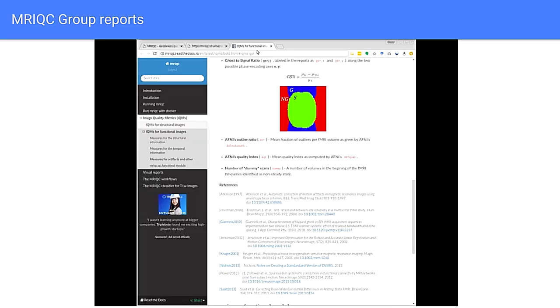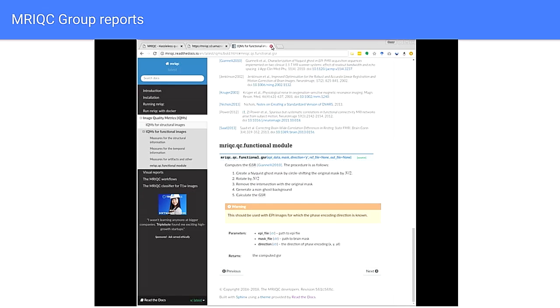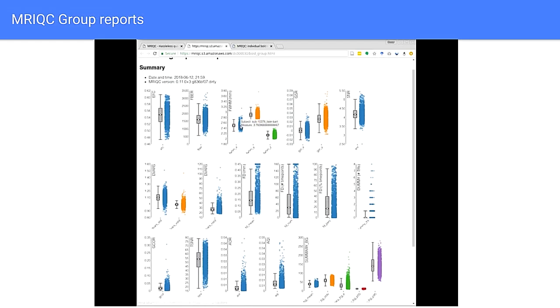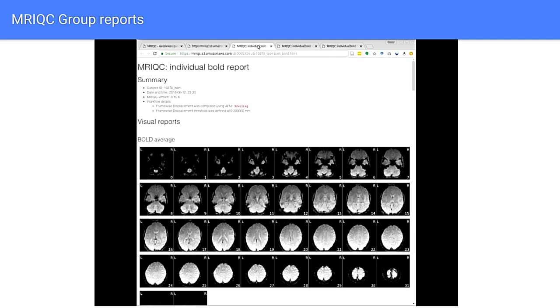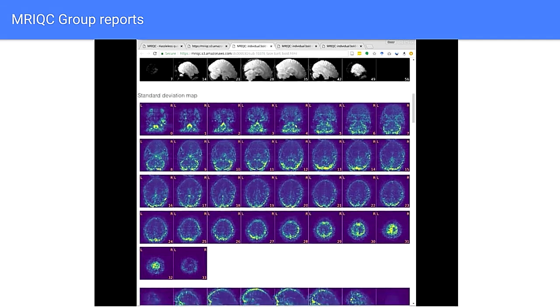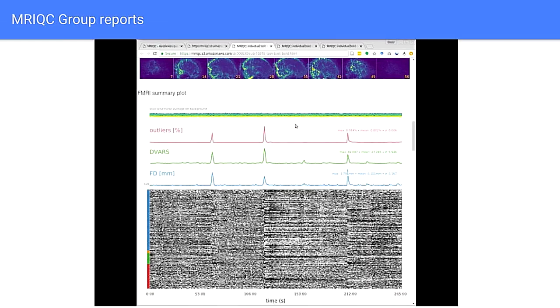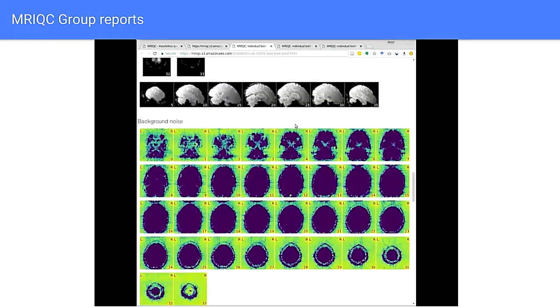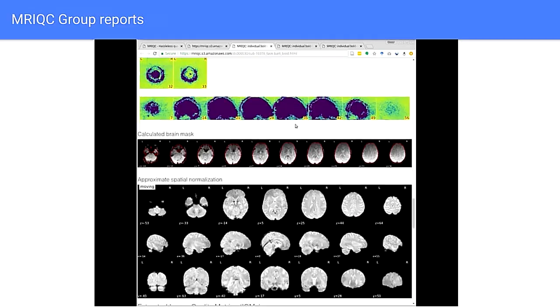So this is another example for functional MRI, and this is one metric, the temporal signal-to-noise ratio. And I think I don't have anything else. Yes, I have. So let's look for some outliers here. Let's see, this is a metric related to blurriness, so the first image I will open should be blurry. And this is global correlation. So I'm also opening two examples that seem to be outliers. And this example doesn't look very bad. You have here all the tools I've shown you before. It has some inhomogeneity, but that shouldn't be a big issue. Should be fine.